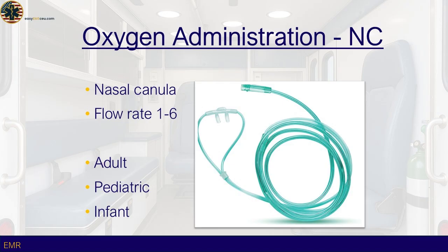In the pre-hospital setting, nasal cannulas are particularly useful for maintaining oxygenation in stable patients while avoiding the risks associated with excessive oxygen administration. For COPD patients, excessive oxygen can suppress their hypoxic drive, leading to respiratory depression, so titrating oxygen to maintain SpO2 levels between 88 to 92% is essential. EMS providers should always monitor pulse oximetry to guide oxygen therapy and adjust flow rates as needed.